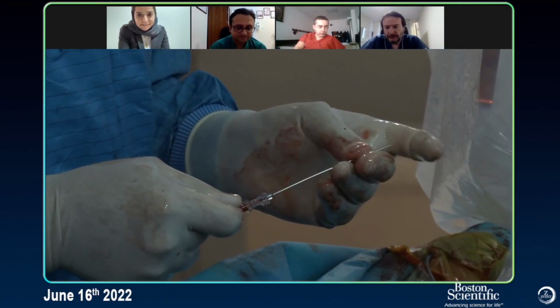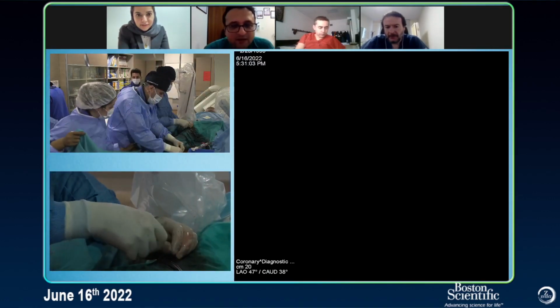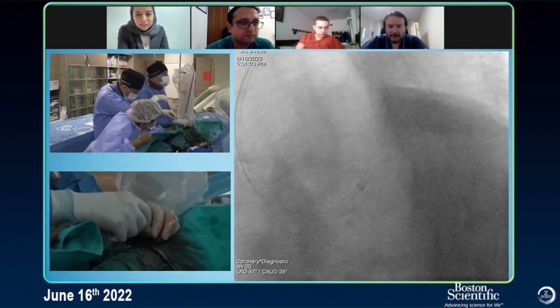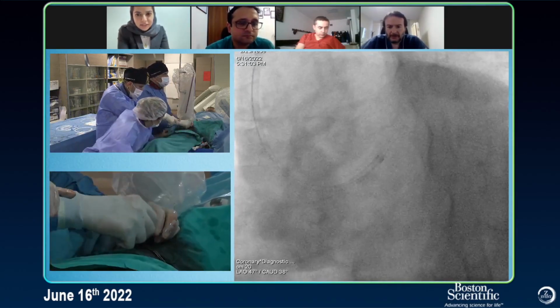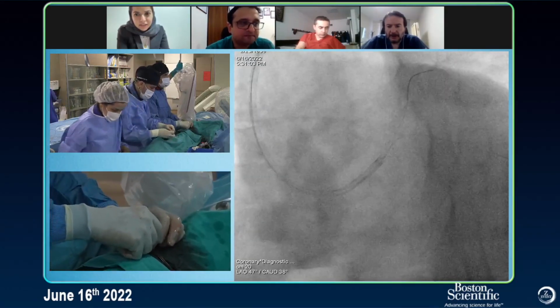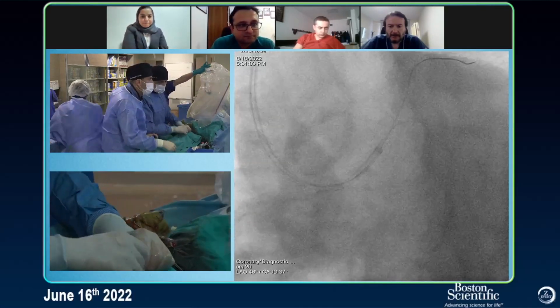The first, let's focus on the LAD first, right? Agreed. How's the patient doing clinically? I can regain the diagonal if something happens, afterwards, after the LAD. I'm lucky that I can cross the diagonal. Okay, another wire.